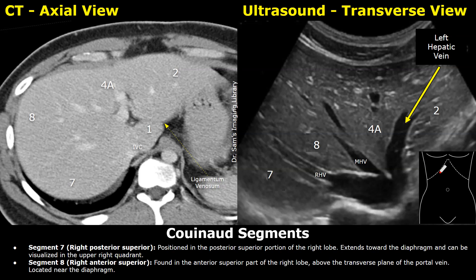In the CT image, segment 7 is behind segment 8 on the superior aspect of the liver. Both segments 7 and 8 are in contact with the diaphragm. Segments 2 and 4a are at the superior aspect of the liver. Segment 7 is the posterior superior portion of the right lobe, and segment 8 is the anterior superior part of the right lobe.